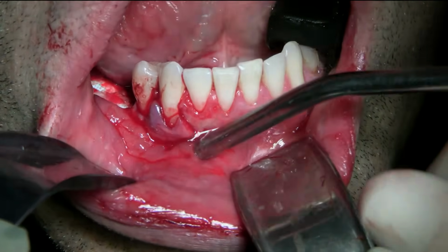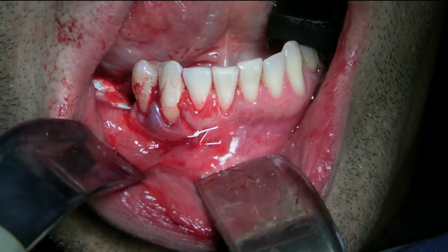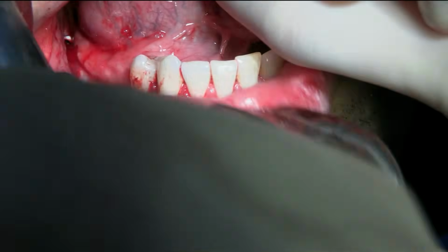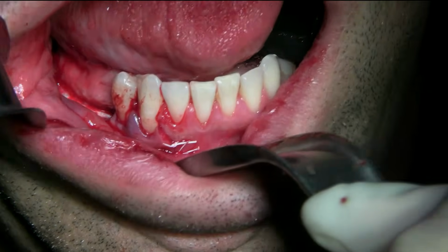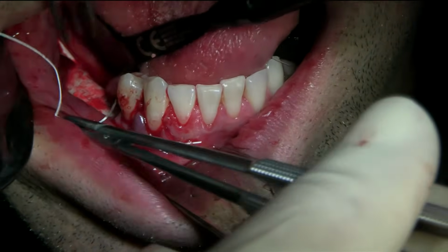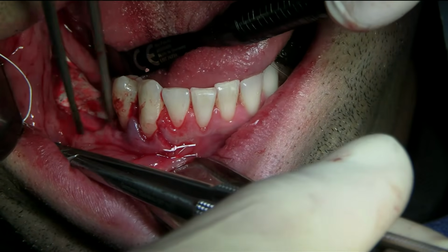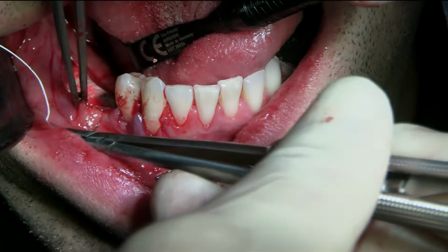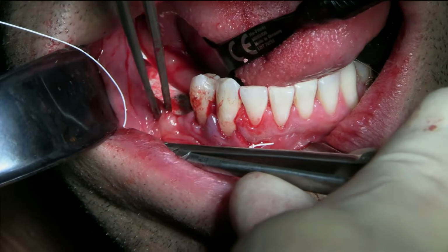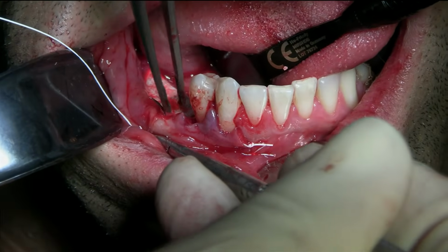Okay, now we're going to go to the crest. Normally I always close the crest first, but in these big flaps with a lot of loose tissue, I like to just have a reference. So let's see. Yeah. Your chin down, chin down, perfect. Yeah. Now I got to grab the buccal and find the margin. Here I am. And that's my distal, so something like this is good. I'll go deep. It's probably like 4 millimeters.